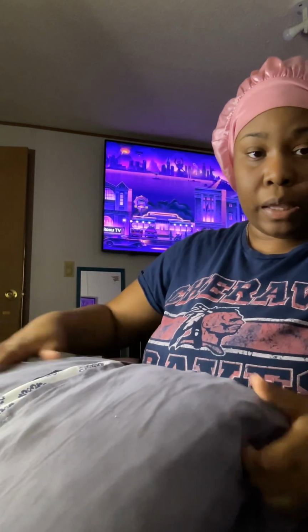So we're going to first get into the dressing. I'm going to take my dressing application. This would be considered a waterproof application just because she will have to get up and do some walking around, do some bathing, showering, and you want to keep the dressing waterproof. I'm going to lay her like this.